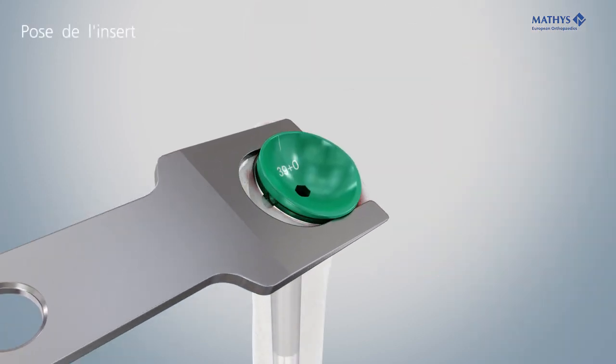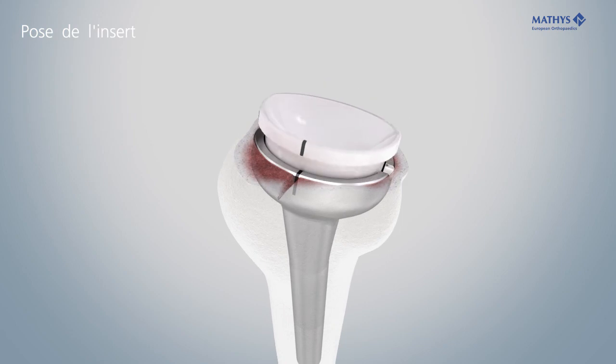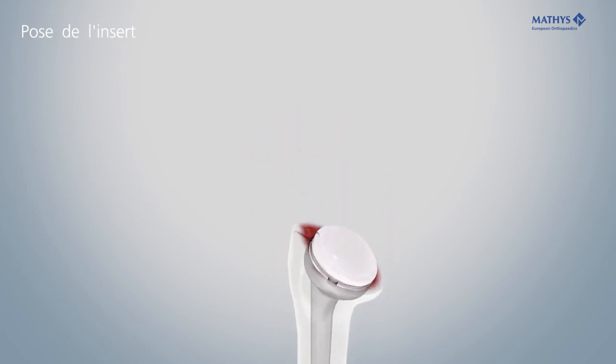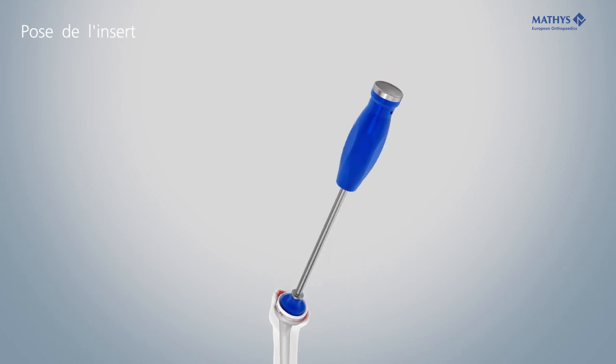Remove the trial inlay with the inlay extractor. Insert the inlay. Ensure that the lateral laser marking of the inlay is precisely aligned with the stem marking. Definitive fixation of the inlay is achieved by applying a distinctive hammer stroke onto the impactor in axial direction.